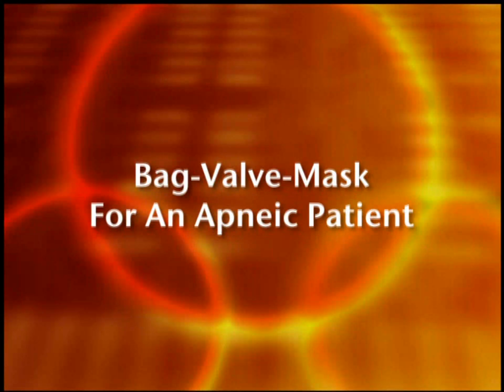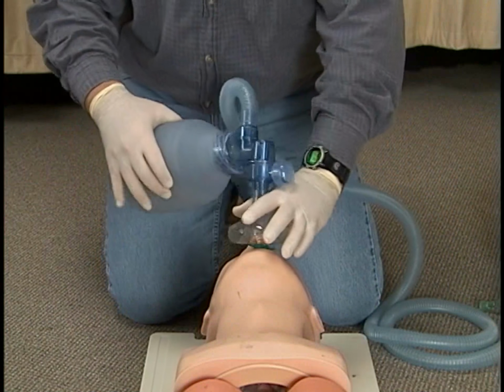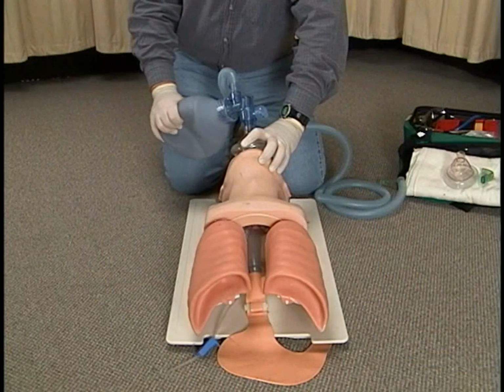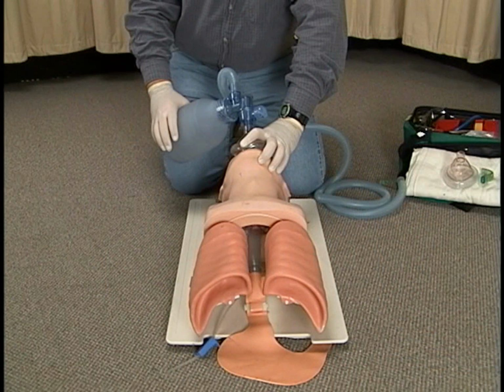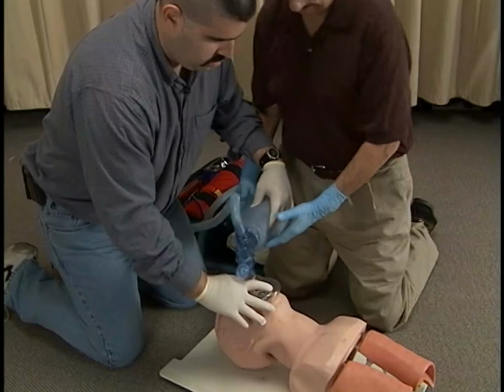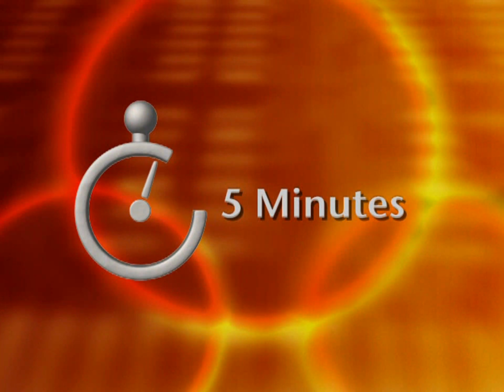This station tests the EMT candidate's ability to use a bag valve mask effectively to ventilate an apneic patient. In this station, the candidate will perform both 1 and 2 rescuer BVM ventilation. A second EMT will arrive to assist with 2 rescuer BVM ventilation. This station should take approximately 5 minutes to complete.